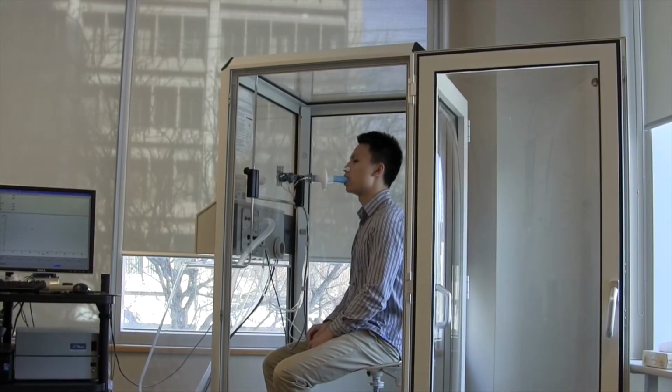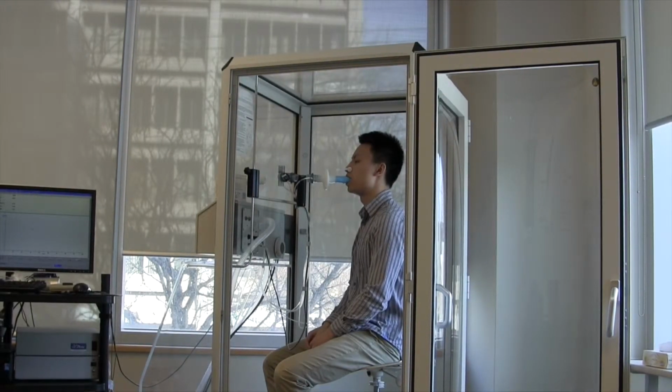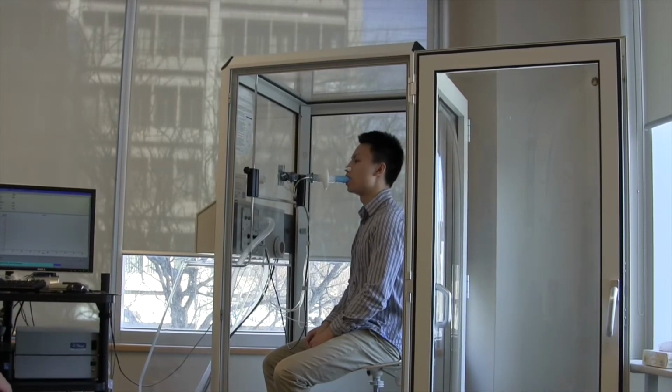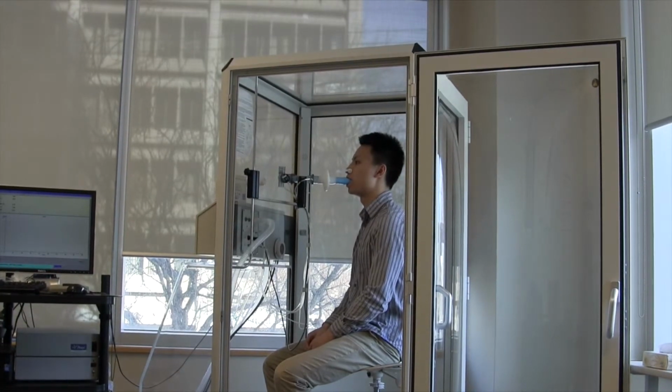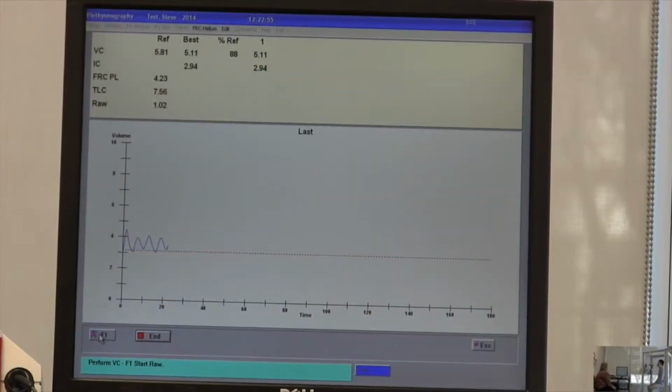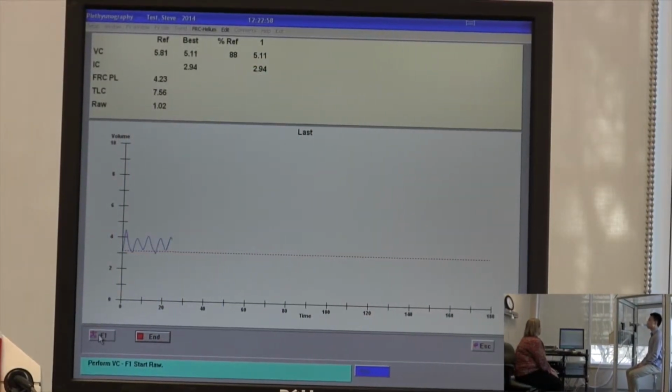So just a couple of normal breaths to start. Perfect. Normal breathing. Normal breathing. We're just getting a baseline here, so that's perfect. Nice and relaxed breaths. Okay. So big breath in.